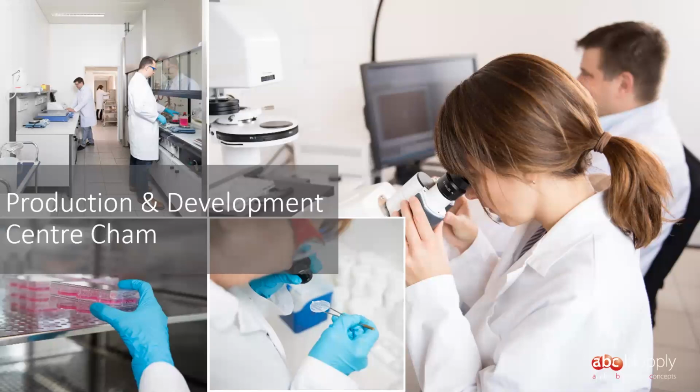What has been done, though, is that people have prepared matrices such as Matrigel or collagen. They have subsequently shredded those matrices so that they got a kind of suspension of tiny little shredded particles of Matrigel and also of collagen. And then those little particles can be diluted, sort of like in a cell suspension, and then centrifuged to the bottom of the microcavities.